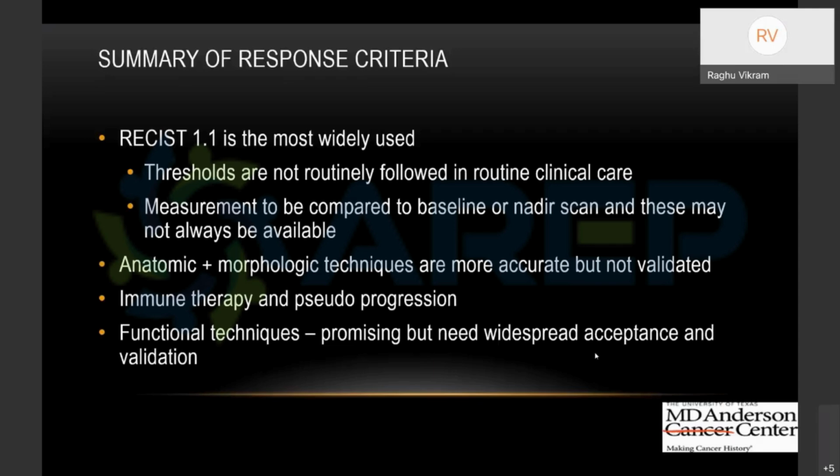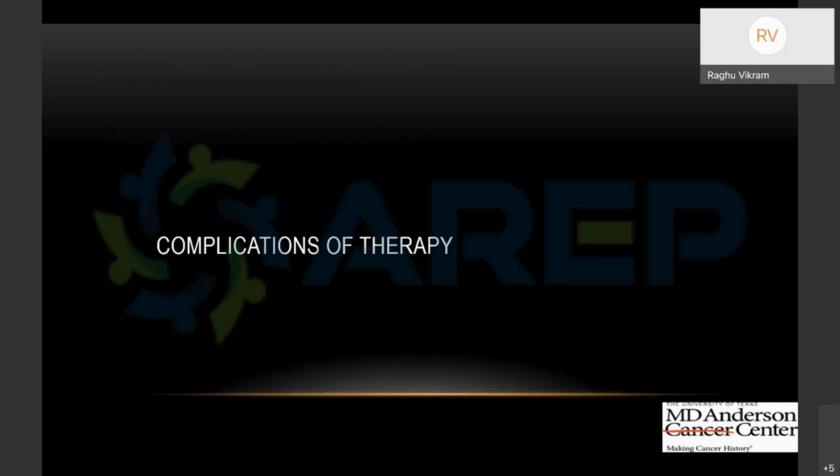One of the problems with that is it's very time consuming, and also if you're using CT, a lot of radiation. So we have shied away from using that in our institution. Complications of therapy, I think, is one of the most important that we come across and less talked about. I'm going to spend a little bit more time on this, and I'm willing to stay back to take questions later, because I think one of the most common presentations to our ER, that is emergency room, is actually complications of therapy.